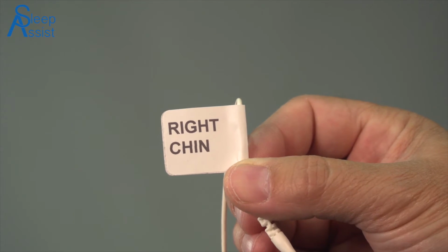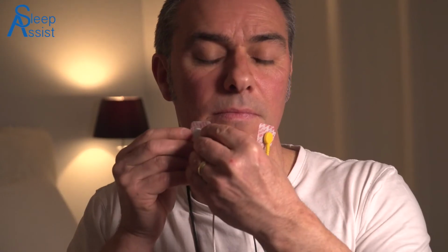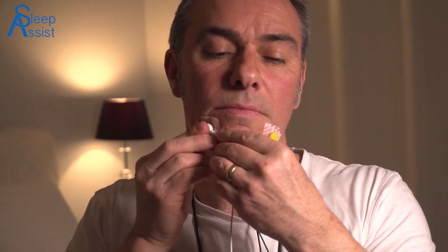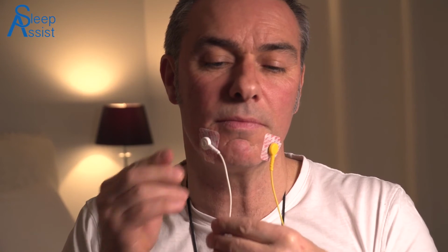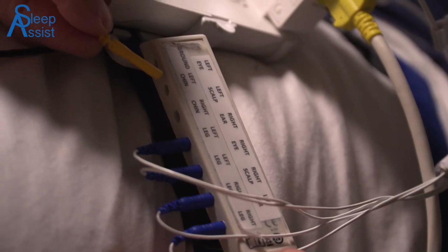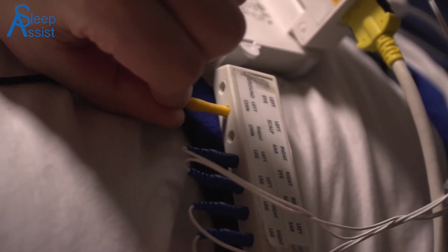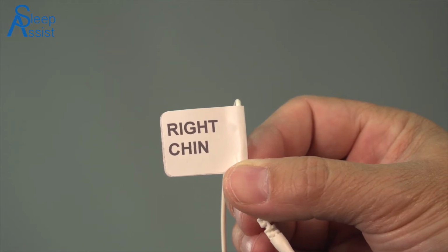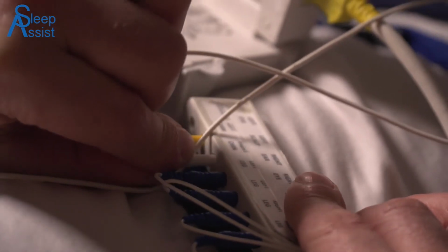Apply the adhesive electrode labelled right chin. Repeat this procedure on the left side of your chin using a fresh cotton bud and a fresh alcohol swab, and apply the adhesive electrode labelled left chin. Insert the lead marked left chin into the multi-lead port box labelled left chin. Insert the lead marked right chin into the multi-lead port box labelled right chin.